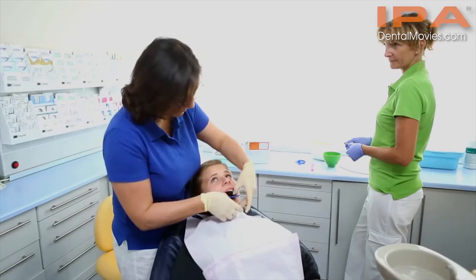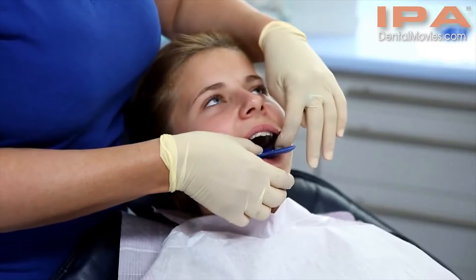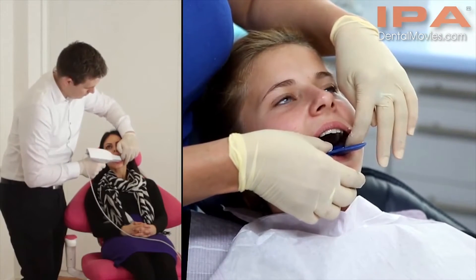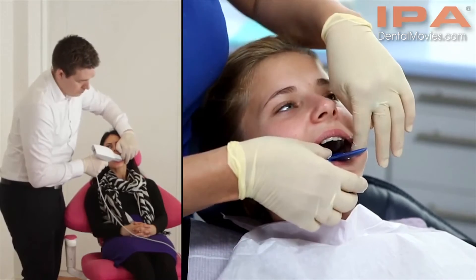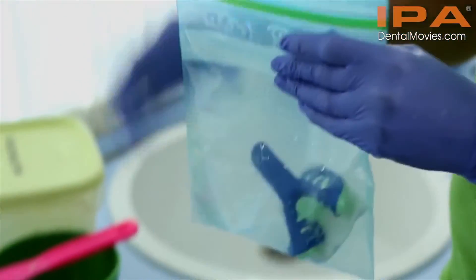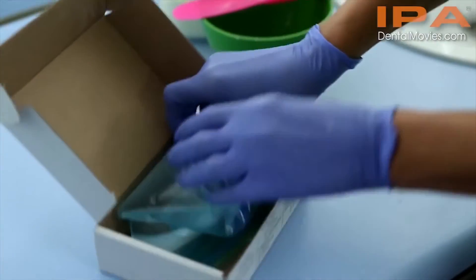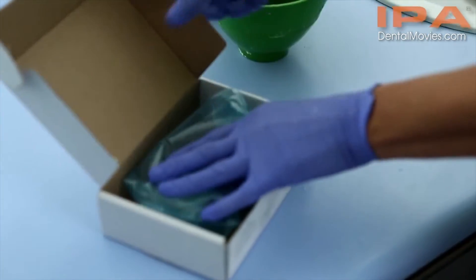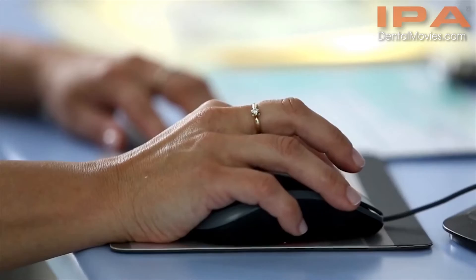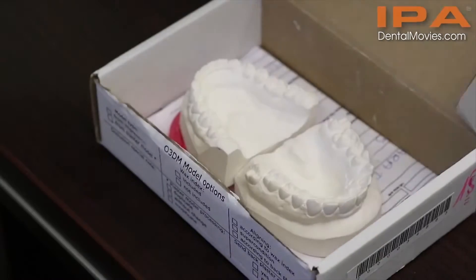Working with the IPA system starts with impression taking and bite registration and it also includes scanning the patient's occlusion. The impression or the digital file is transferred to a local orthodontic laboratory equipped with IPA technology where it is transferred into a ready-to-use virtual model.